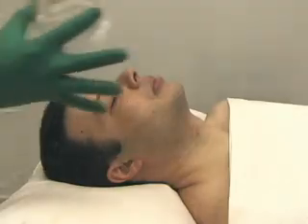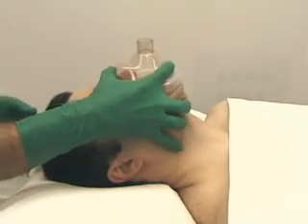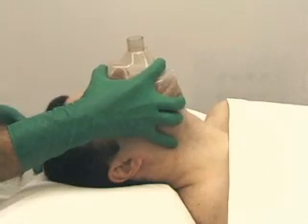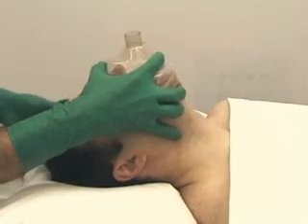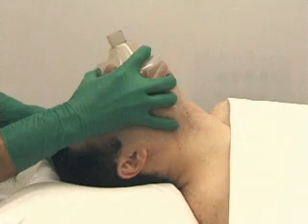The most common method to hold the mask consists of placing the thumb and index finger on the body of the mask while the other fingers pull the jaw forward and extend the head. The middle and ring finger are placed on the ridge of the mandible, and the fifth finger is placed behind the angle of the mandible.